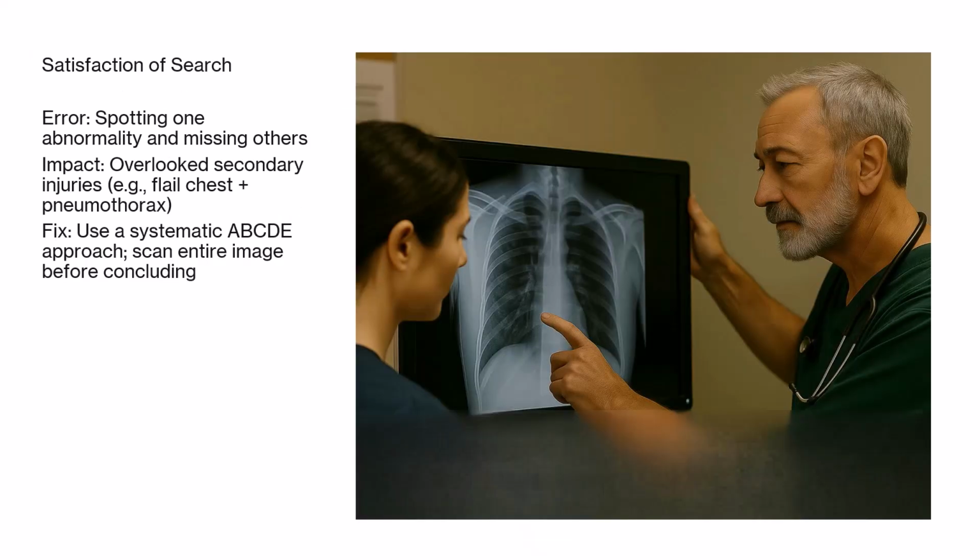Remember, you're there not to diagnose, but to detect. And if you detect something immediately, don't get too excited and show the doctor immediately. Take time to take a look and analyze the entire image. You don't want to overlook other injuries by focusing on the first one that you see.